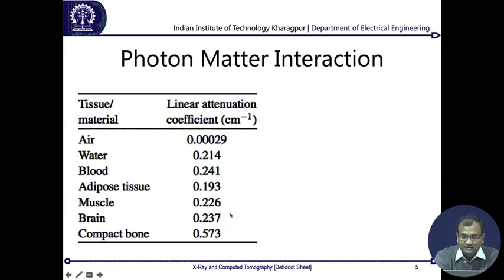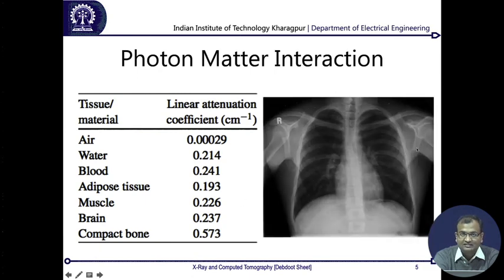That's the reason that in a chest X-ray your bones are always brighter. Now the point is, I also see this part bright. This is my upper abdominal part, just below the diaphragm of my chest. These are my lungs, this is where my heart is, and this is where my whole gastric cavity is present. Most of our gastric cavity is made out of adipose tissue and muscles.